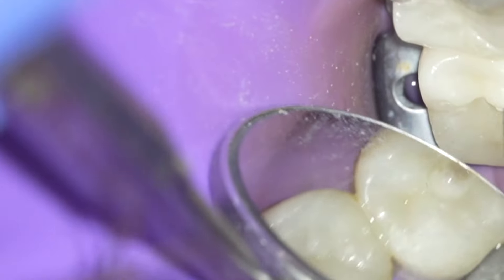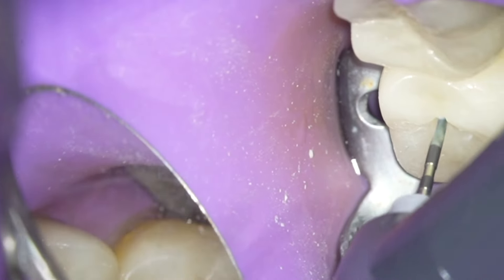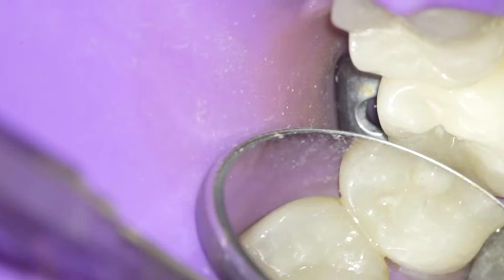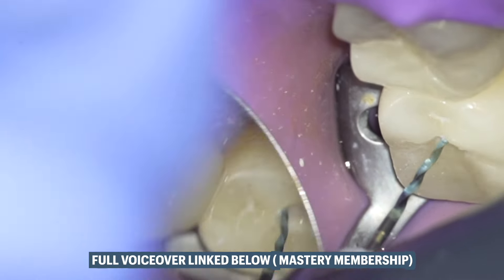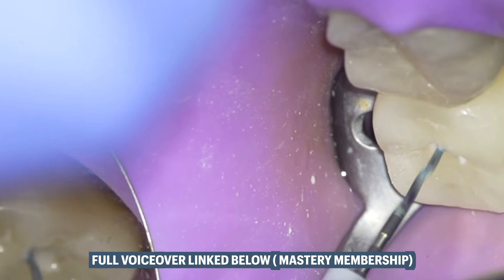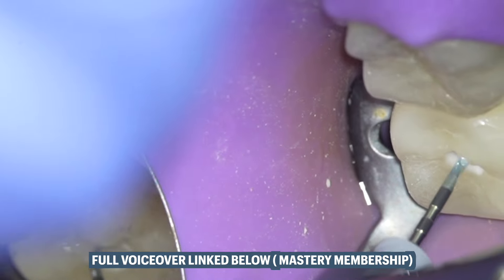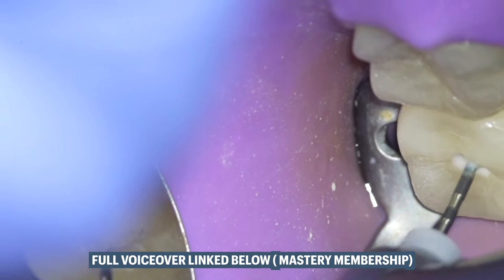Once I got the initial few millimeters with the hand file, I'll go with a very small rotary file just to open up and create somewhat of a glide path. I'm not creating the glide path all the way down — I'm going down with what the canal gives me. If I feel too much resistance, I'm not pushing it down.